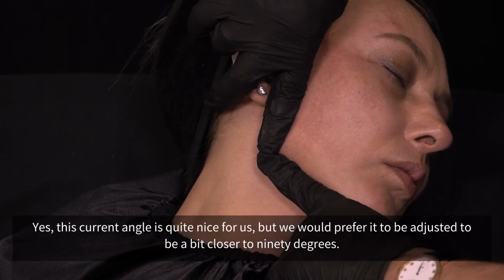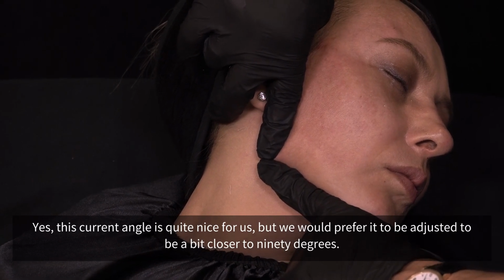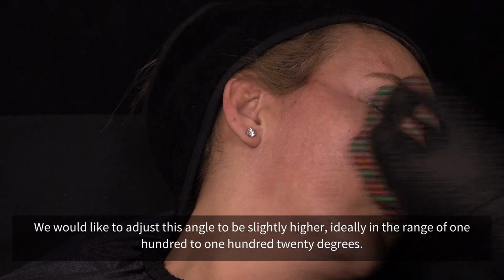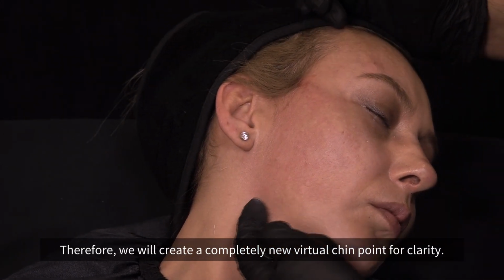Yes, this current angle is quite nice for us, but we would prefer it to be adjusted to be a bit closer to 90 degrees. We would like to adjust this angle to be slightly higher, ideally in the range of 100 to 120 degrees. Therefore, we will create a completely new virtual chin point for clarity.